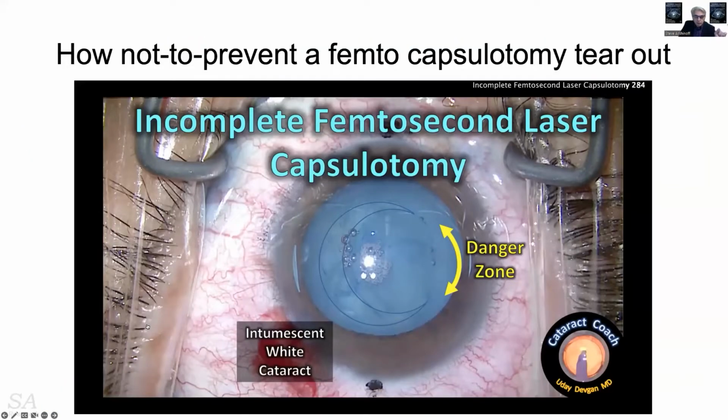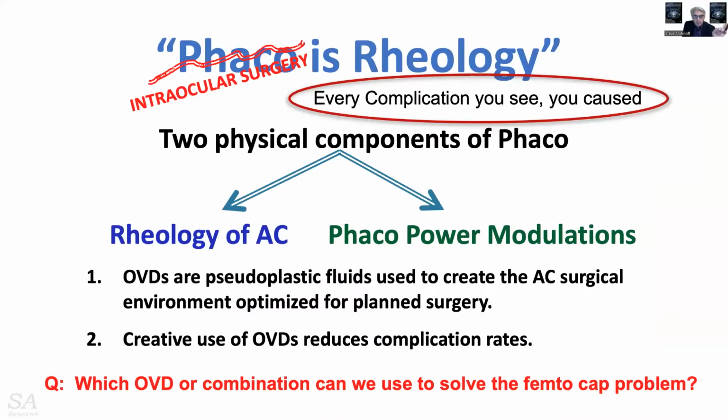He filled the anterior chamber with VisionBlue right away. What that does is decrease the pressure on the capsule in the anterior chamber, and those particular anterior capsules tend to tear out when you decrease the pressure. So let me show you how to approach those.